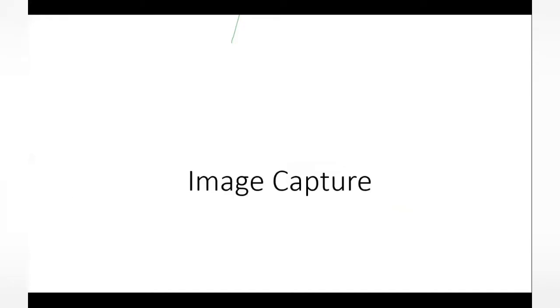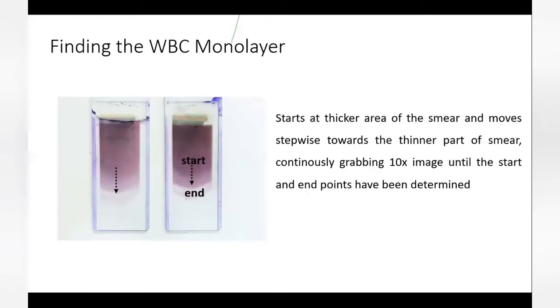So while we just saw what the science behind this is, we'll see quickly how the image capture happens, and what the machine does at the back end. Again, these are not relevant to the pathologist when they're reporting, but this is a science that you need to understand, including what goes into it, and what is the difference largely between a digitized or scanned image versus a digitized image with software that is able to give you AI-based reporting.